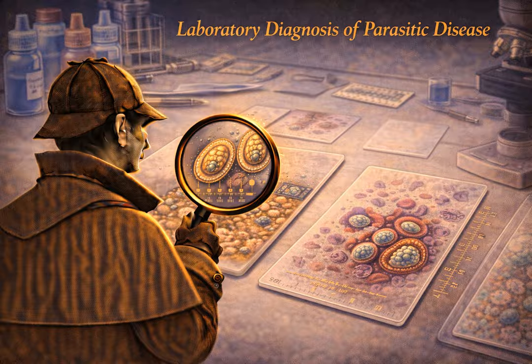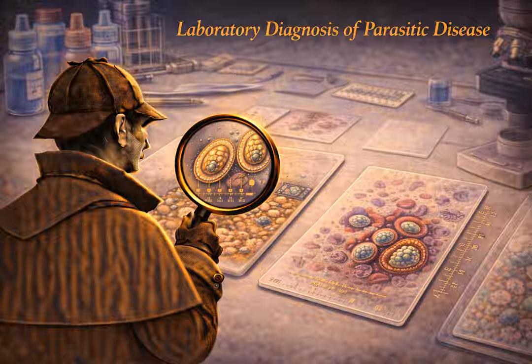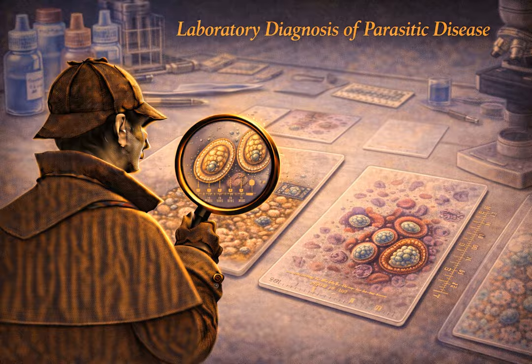Exactly. Under the microscope, Babesia ring forms look almost exactly like early malaria rings, small purple circles inside the red cell. But Babesia has a very specific replication trick. It occasionally forms tetrads, 4 distinct rings arranged together in a perfect cross shape.